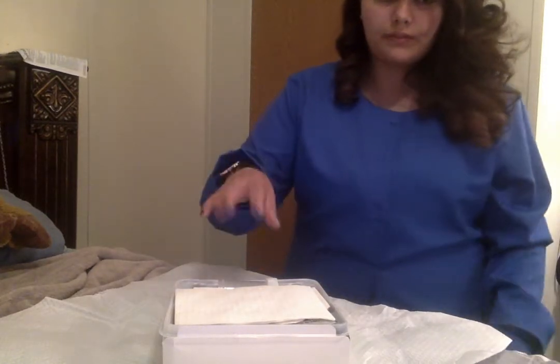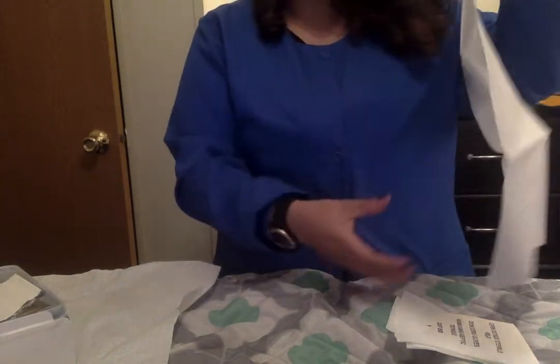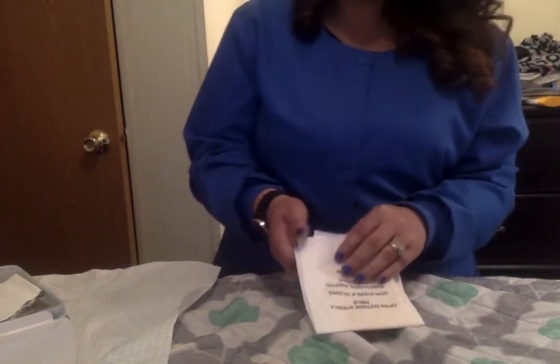Now we are going to apply the sterile gloves. Okay, so I'll open the sterile gloves over here. We're going to go ahead and put this underneath our patient. We're going to put this shiny part up. I believe I remember her saying that. Okay, now we're going to open our sterile gloves.